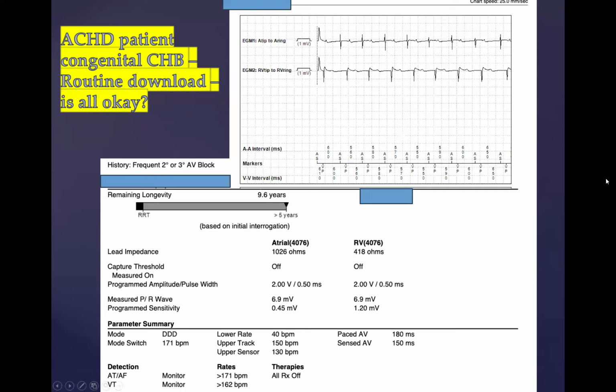Let me ask you this. Do you notice on the atrial electrogram, this is the A, right? Because you can see it says A sense. Why is there this little signal that follows every A, you think? So these are the A sensed. And you notice it isn't noticing anything here, but there's this big signal, which is the atrial electrogram, but then there's this kind of little signal over here. This was the intrinsic P wave. It's the what? Intrinsic P wave, you said? Yes. Okay. No, that's not what that is.